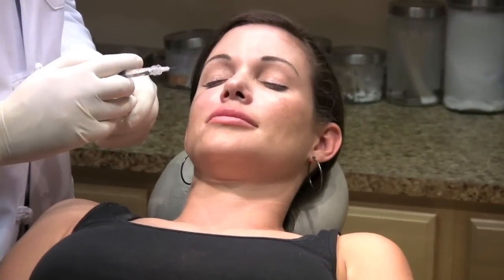So, as we talked about, there's 2 ways of doing this injection. Under the lips, sliding just like a dental block, filling the area. That's a nice way of doing it, but when you need more control, penetrating from the outside right down to the bone is a much more precise way of doing this. It's really not a painful injection. Patients tolerate this very nicely. The injection is all the way down to the bone, and you fill on top of the bone. You don't want to inject into the skin or subcutaneous area because you'll get lumps and bumps.